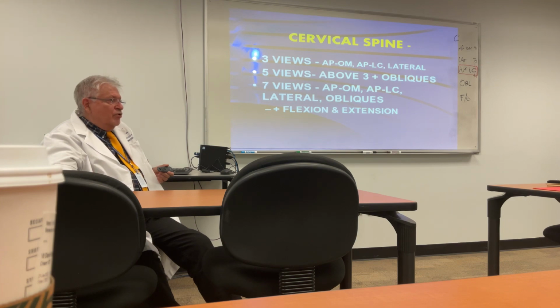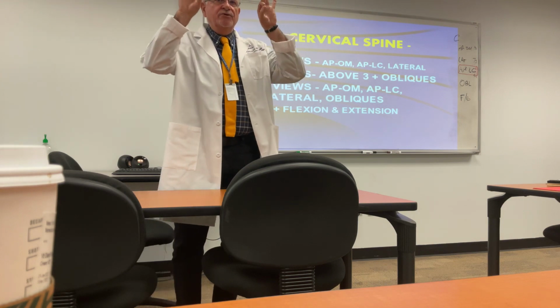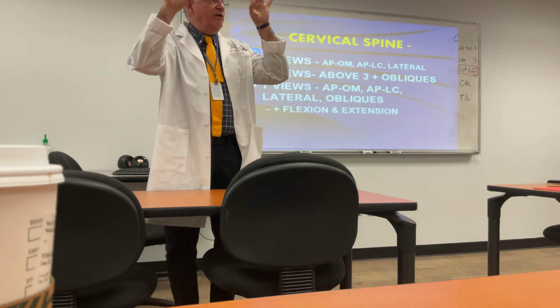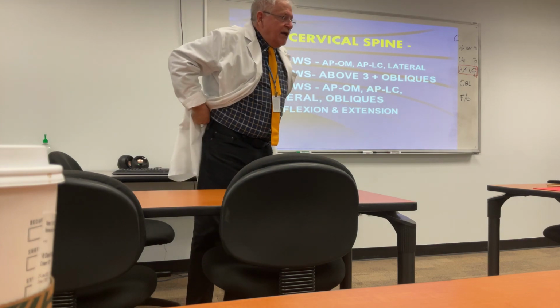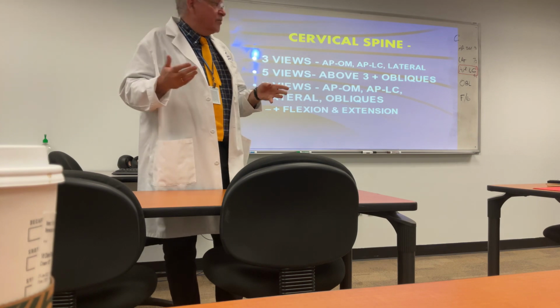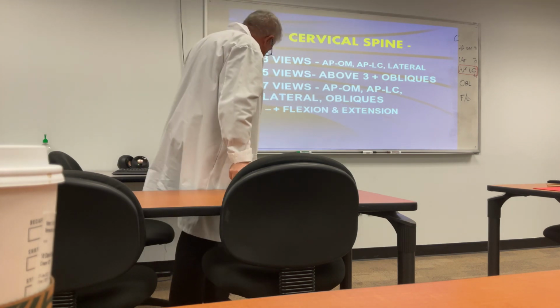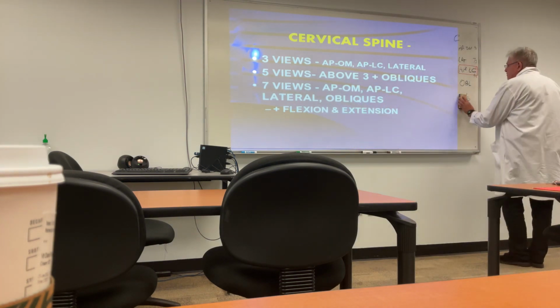The bundle. So in order to see the IVFs, they're not at right angles to where you are. They're at 45 degrees. So we're going to make our patient stand at 45 degrees, and they need a tube tilt. So the challenge with oblique views is tube tilts. All right. So that's what we want to cover in addition to flexion and extension.